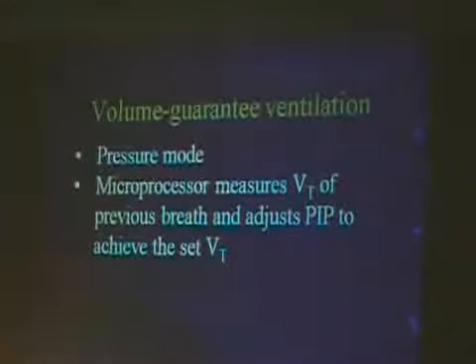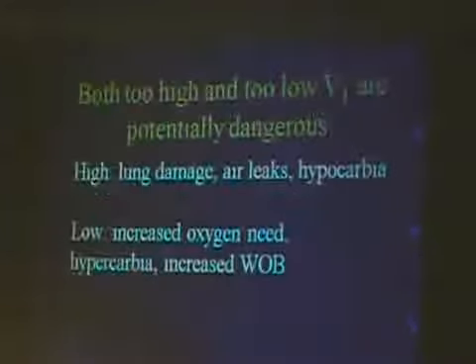It shows that when you use these modes, incidence of bronchopulmonary dysplasia is decreased, which is obviously why all the ventilators are now going to this. This was first run up the flagpole by Draeger with volume guarantee, and now everyone else is realizing, based on the studies that have been done, that this is really where we need to be going. And that just setting a tidal volume and coming back every few minutes to make sure you're in the right range is not nearly as effective or possible, because we can't even do that, as volume control, volume guarantee modes.